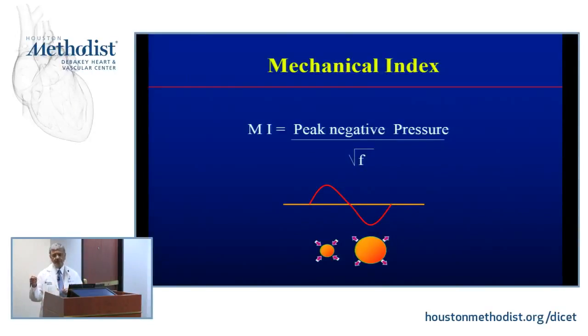And if you think about these ultrasound waves, if you remember the first lecture, which has been viewed more than 11,000 times, that first lecture tells you that I send packets. See this little wave there? Usually there are packets of about 3 or 4. And in that packet, there's an intensity to the wave, positive as well as negative. You see the positive here, right? And then the negative going down.